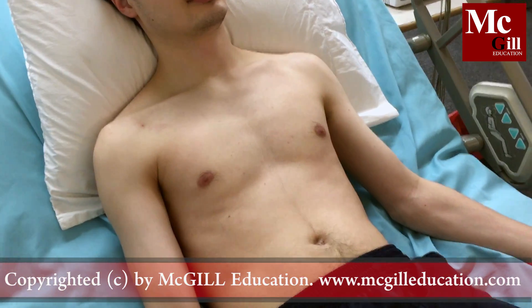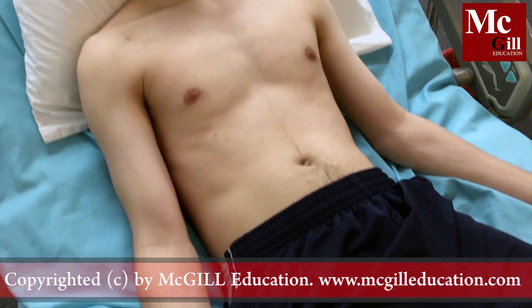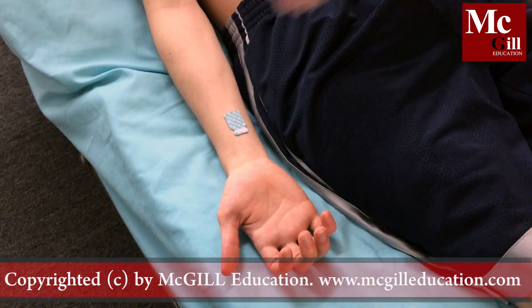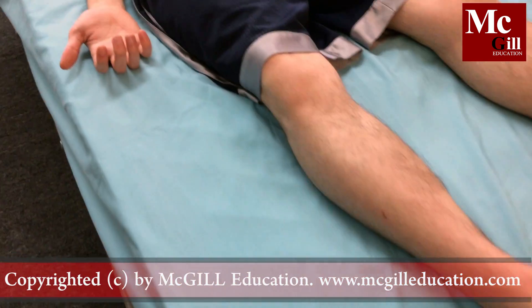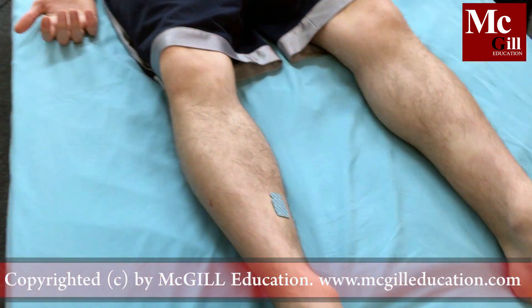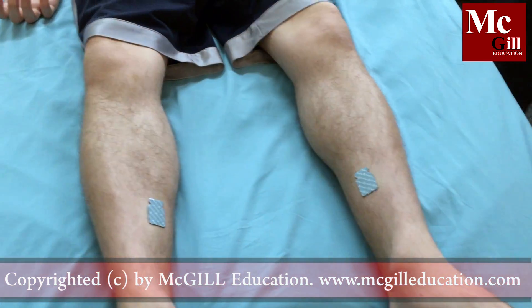Apply limb electrodes. Position the right arm electrode, right leg electrode, left leg electrode, and left arm electrode.